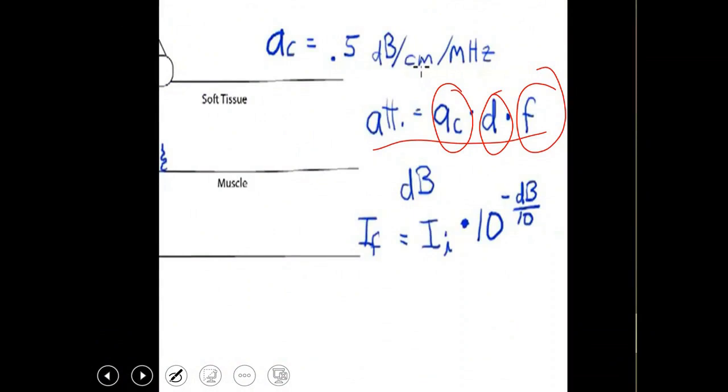Attenuation refers to the original signal that has significantly lost strength. For example, a signal that was originally 100 has reached this interface at a level of 30 due to the effects of reflection, absorption, and whatever else has happened. What has occurred to the signal that reached here at 30? There is an attenuation of 70 due to anything that displaced the ultrasound pulses and lost the characteristics of their original beam. This indeed reflects the attenuation.